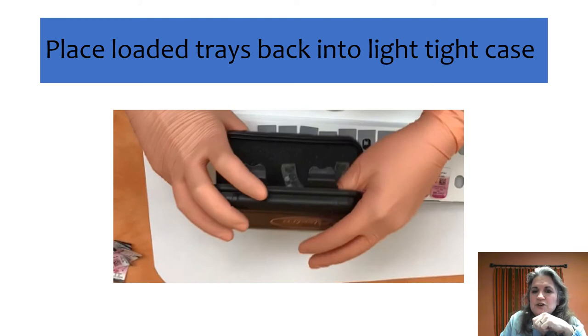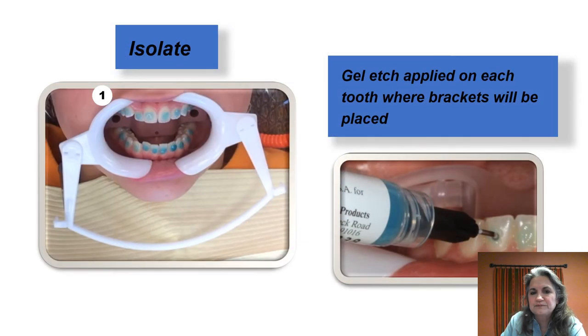After the trays are loaded, put them back into the light-tight case — that's how we take them to the patient chairside. When we get to the bonding process, we like to isolate. We'll use a tongue guard; we don't need the suction part of the NOLA. We put the tongue guard in and then remove it when we go to seat the tray — it's more just to give the patient something to rest on.